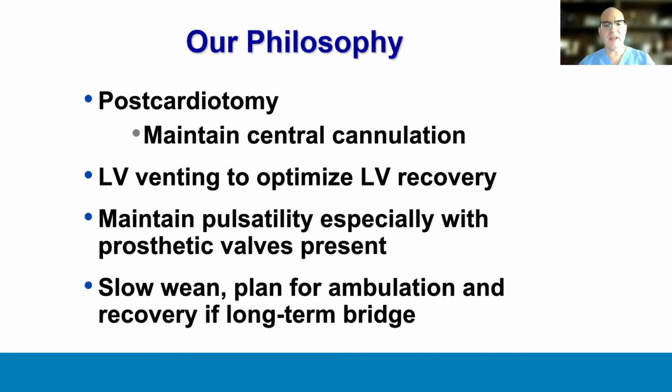So in terms of our philosophy, in terms of post-cardiotomy configurations, we prefer to maintain central cannulation. You can tunnel the cannulas, and if you really want to close the chest for an extended period of time, have the patient get up, walk around. And if it's within a couple of weeks, opening the sternotomy back up and decannulating is really not that big of an operation.